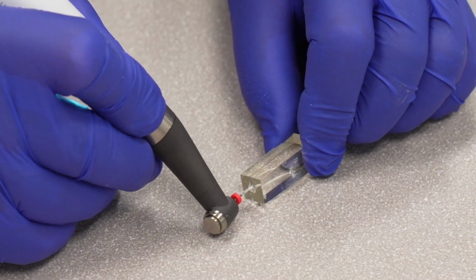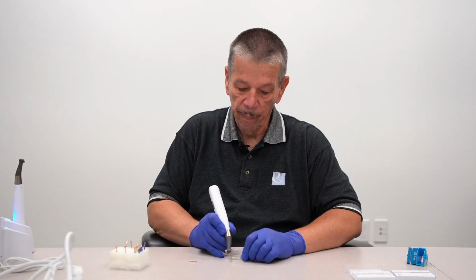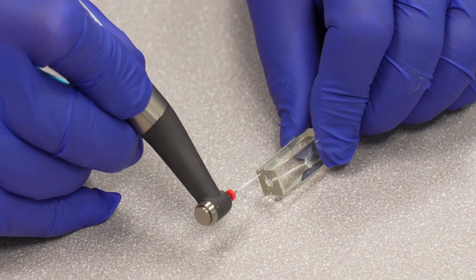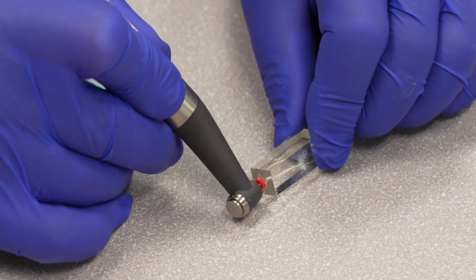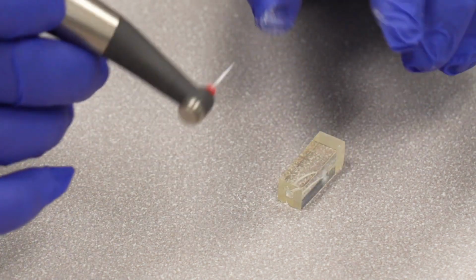So brushing on the way out meaning putting some cervical pressure on the curve till you reach working length, and that's basically working length, and you're done.